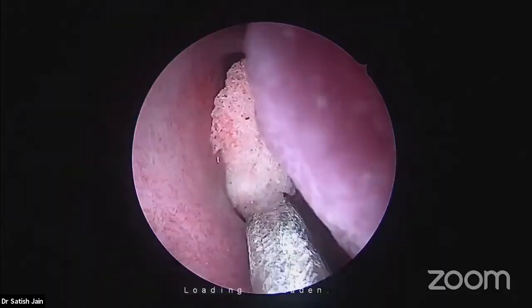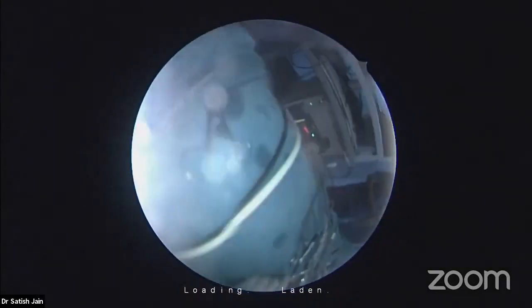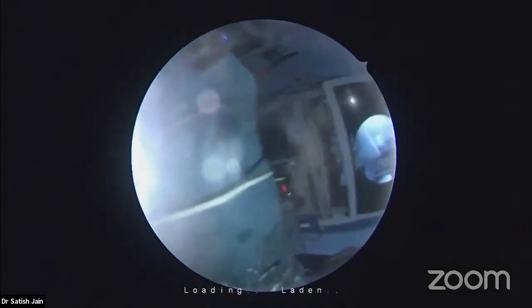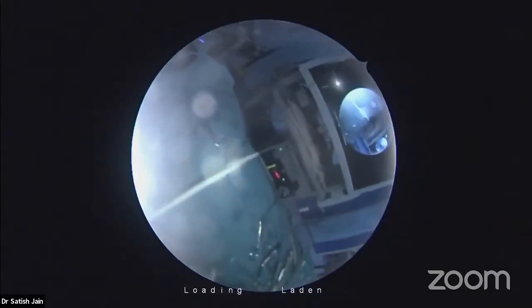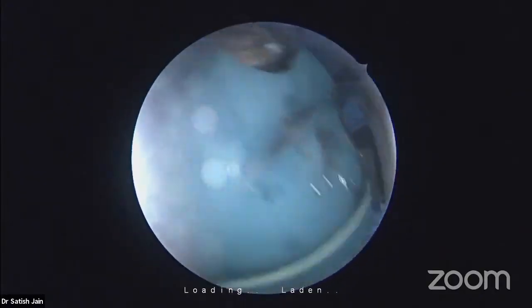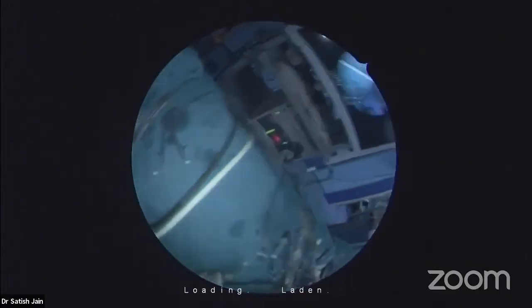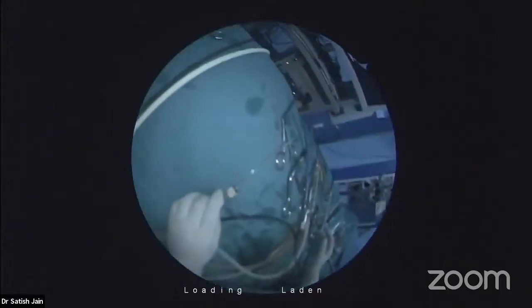Number two, literature has disproved it. The size of the antrostomy now is related to the demand of the topical steroid post-operatively. For example, in a patient with a massive eosinophilic profile, I would like to create a mega antrostomy to deliver more and more topical steroid. In a patient with more massive fungal disease, I would like to create a more massive mega antrostomy for lifetime surveillance, lifetime irrigation, more steroid going in. All are the purposes for a mega antrostomy.